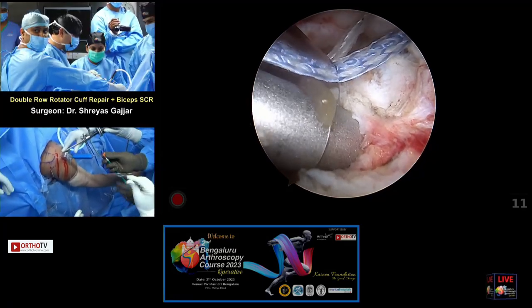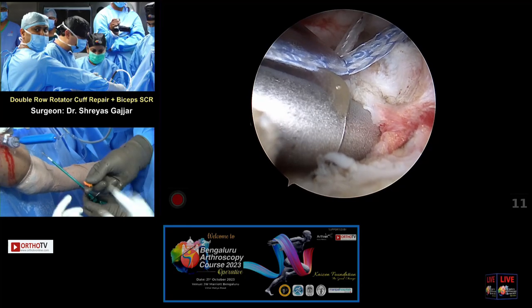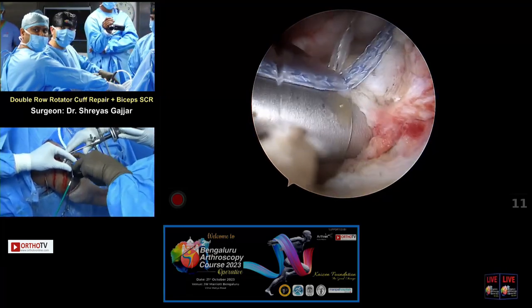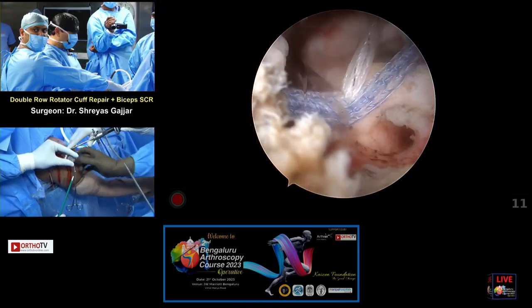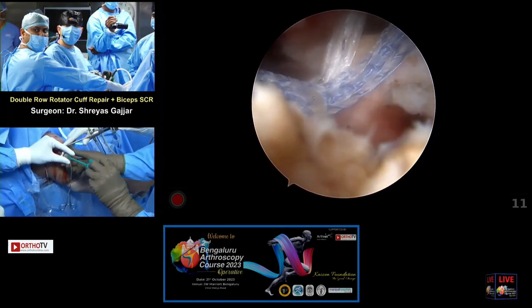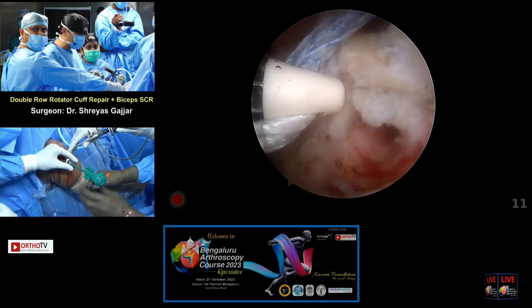Mosquito, thank you. So before I remove the punch, I tend to feed the anchor on the tapes. Akshay, can you hold the anchor? And the cannula, perfect. Don't let go of the cannula. Now I'll show you a tip. Hold the cannula. One way to ensure that you don't lose the hole with the bursa and all is to keep the cannula flush with the hole. But this is a good area to visualize, so I'm not worried.